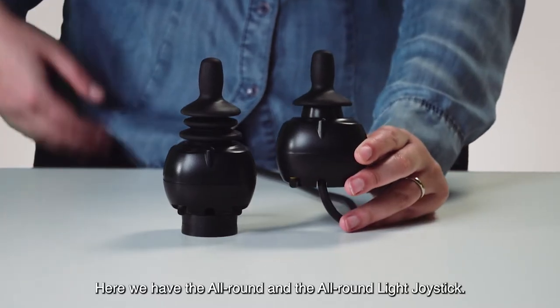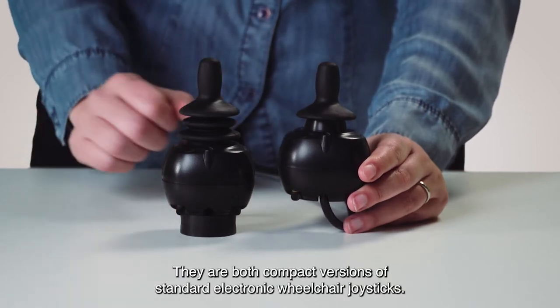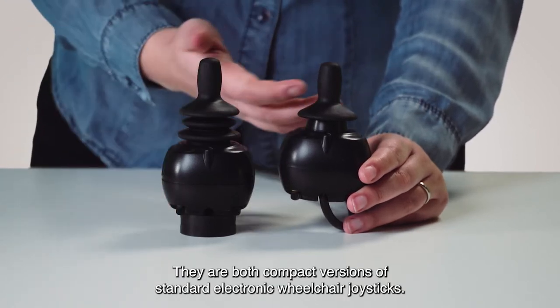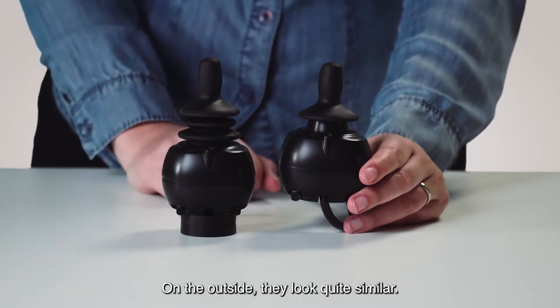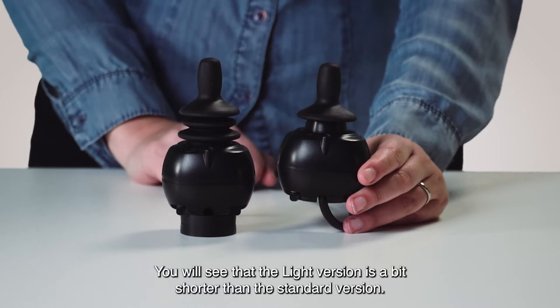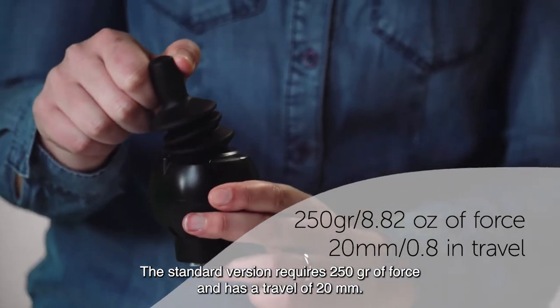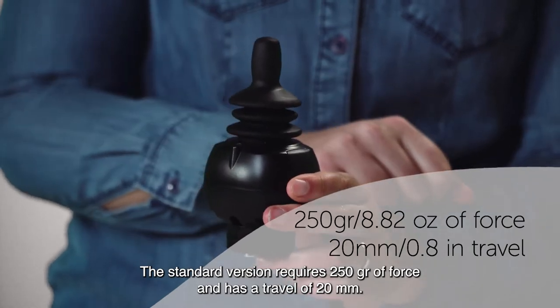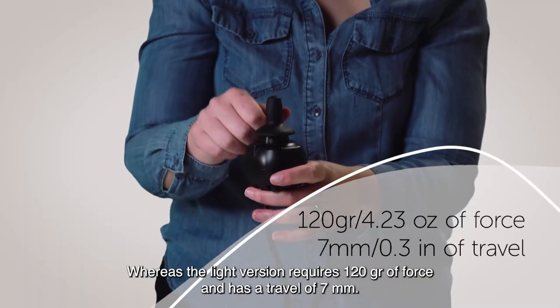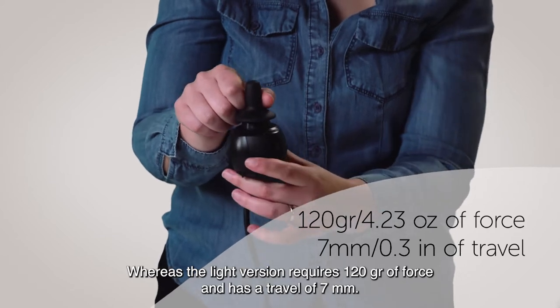Here we have the all-round and the all-round light joystick. They are both compact versions of standard electronic wheelchair joysticks. On the outside they look quite similar, though the light version is a bit shorter than the standard version. The standard version requires 250 grams of force and has a travel of 20 millimeters, whereas the light version requires 120 grams of force and has a travel of 7 millimeters.